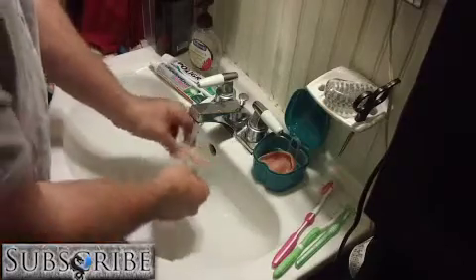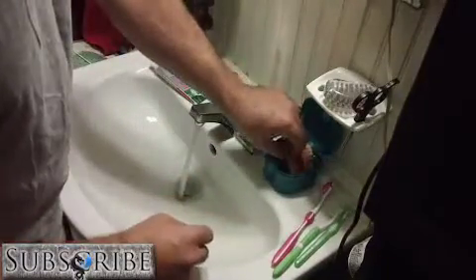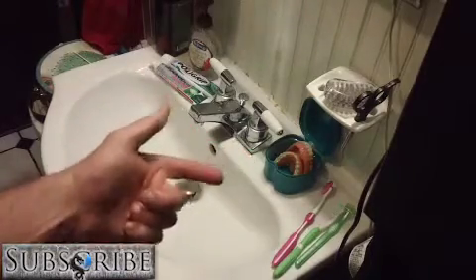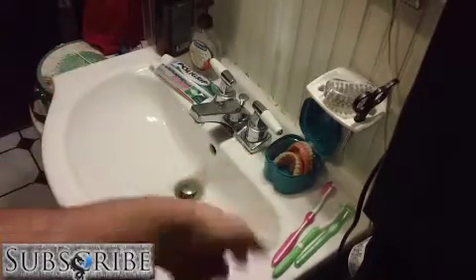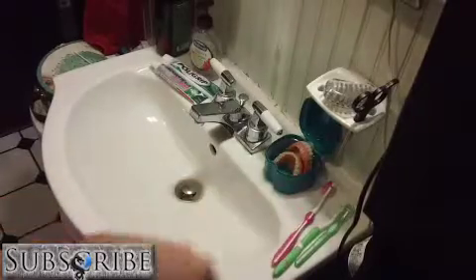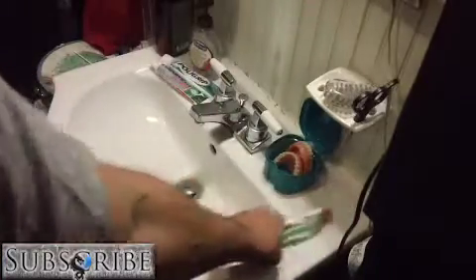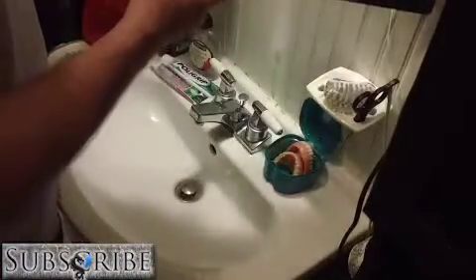So I'll just rinse them off like this. They've already been rinsed off. Sometimes I'll just stand them up in the container, let them drip dry. I don't know if they actually drip dry, but in my own head, it makes sense. So that's pretty much what I do with those. I got my teeth there, I got my glue there, I got my instruments of cleaning there, and I'm going to put these away because I already cleaned everything. You don't need them, and I'll end up knocking them on the floor, and then they're really dirty, and you get it. So those over there.